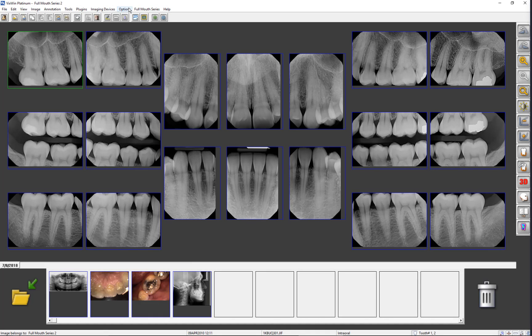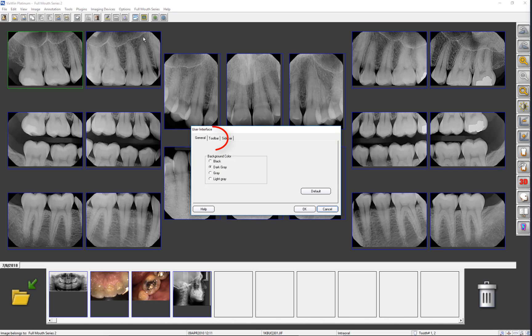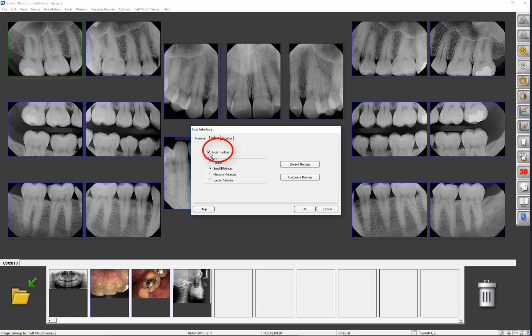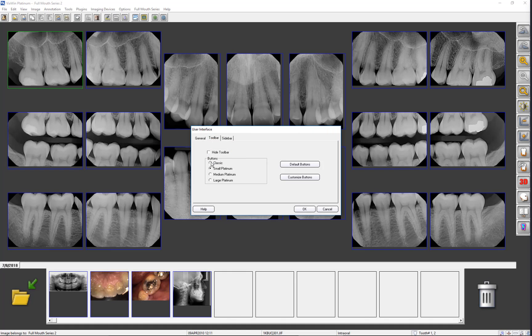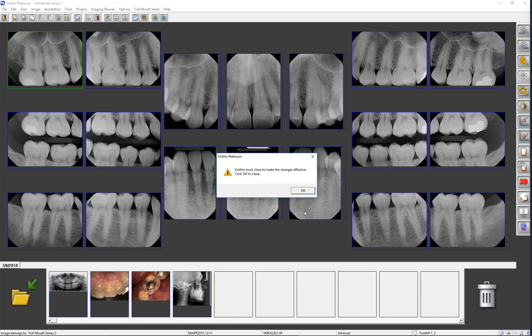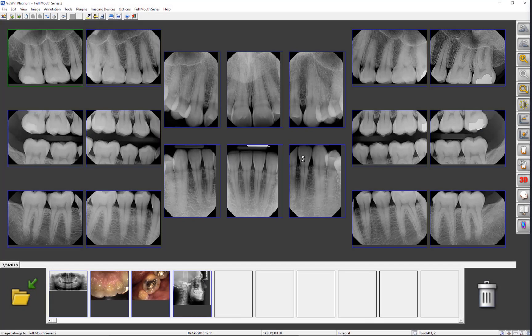Now let's reopen the User Interface and click the Toolbar tab. Here you can hide the toolbar if desired. We can also change the appearance of the toolbar. Let's change to the classic viewing style, then click OK. Once the software is closed and reopened, the change will occur.